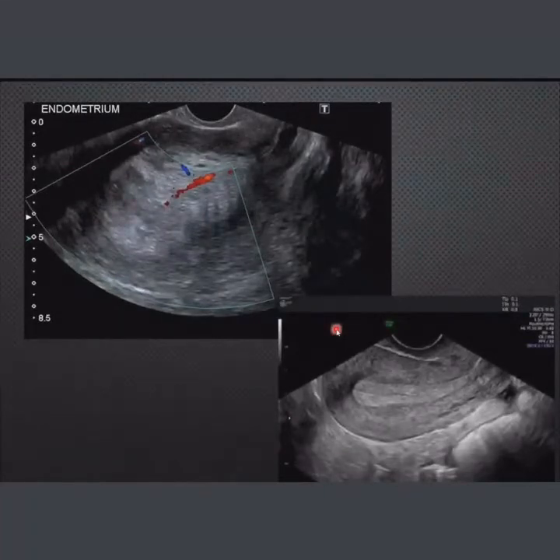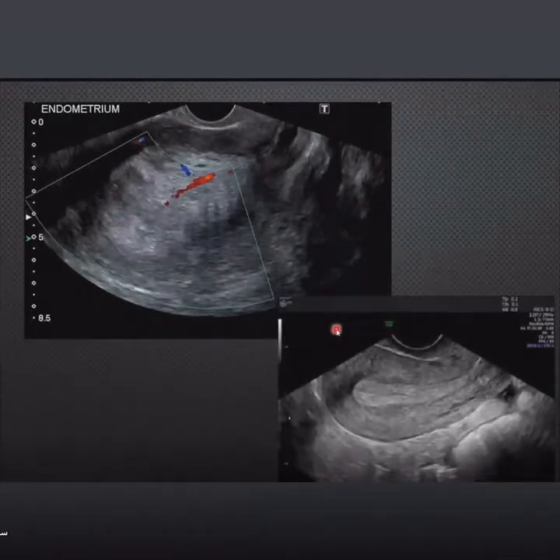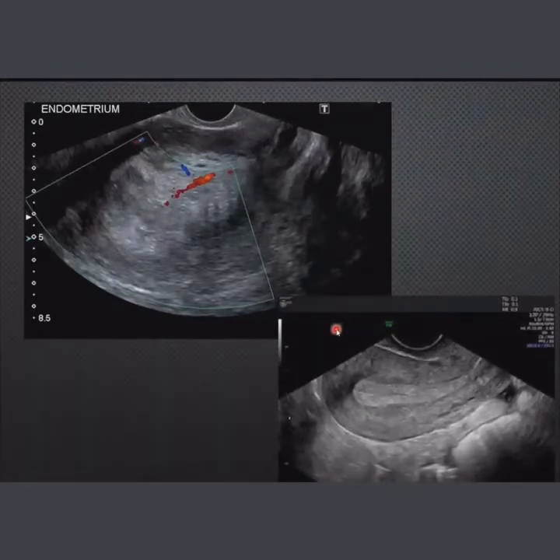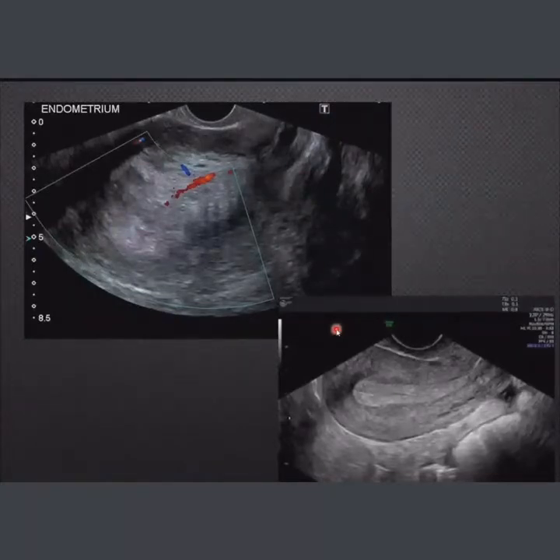اوكي okay. هو بالحقيقه الـ MRI will add a lot for the diagnosis. لكن بالحقيقة التفريق ما بين الإندومتريال هايبرplasia والكارسينوما is by biopsy. يعني أريدكم تتذكرون أنه MRI is usually بالنسبة للسيرفيك واليوتراس is not for primary diagnosis وإنما it is for staging. MRI will stage a known case of uterine carcinoma. It is never the modality of diagnosis, the cervix or the endometrium.